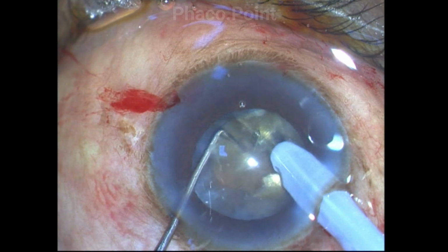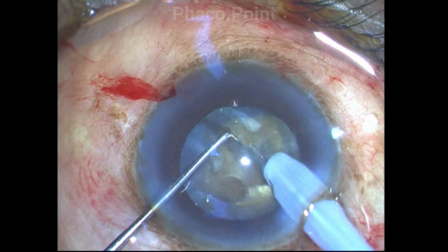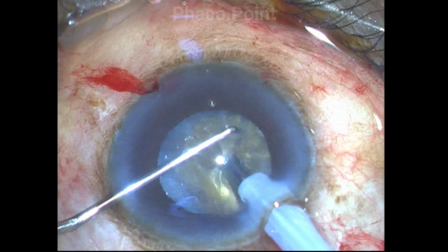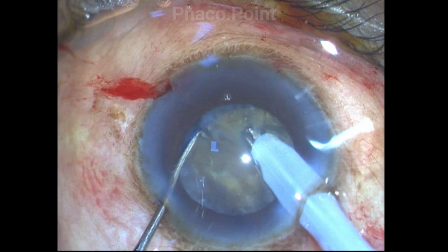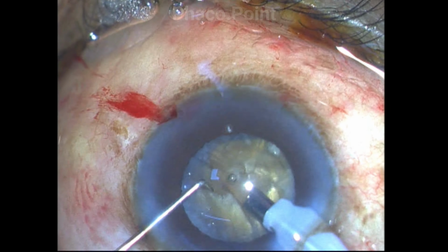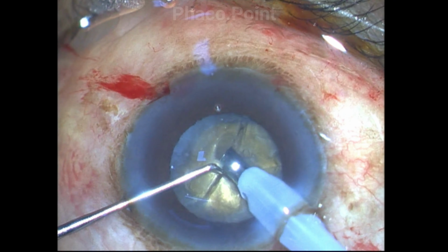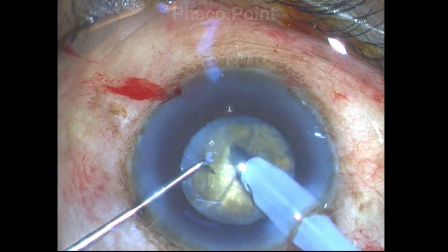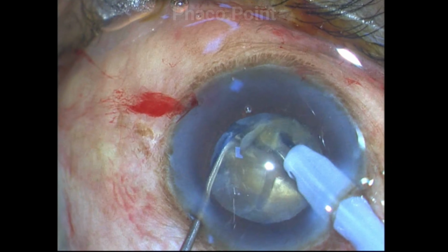Clearly you can note that as the cataracts get denser, the fragments tend to be more dense, but they tend to be more numerous because you have got a larger, thicker, bulkier and more dense nucleus. And needless to say, you are going to use some more energy to emulsify these denser fragments. It's very important to protect the endothelium at all times, to further chop, to give rise to much smaller and therefore more easily emulsifiable fragments.